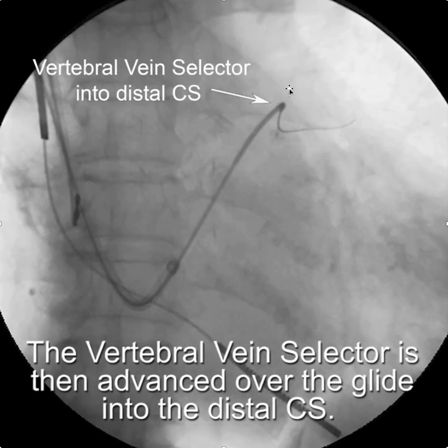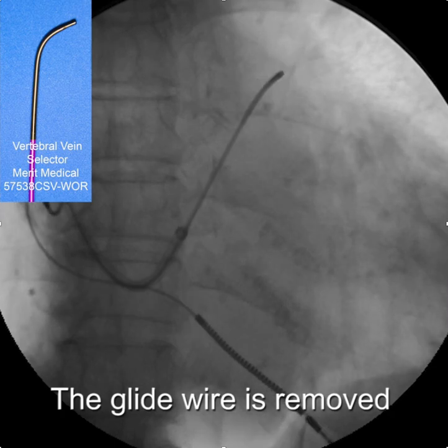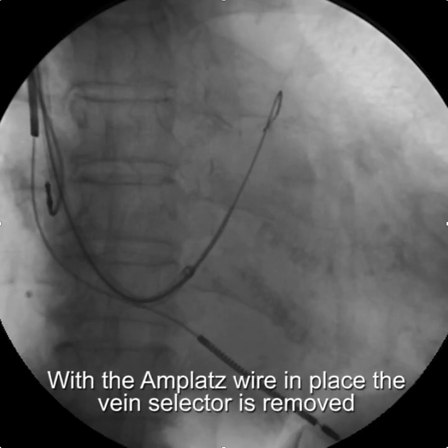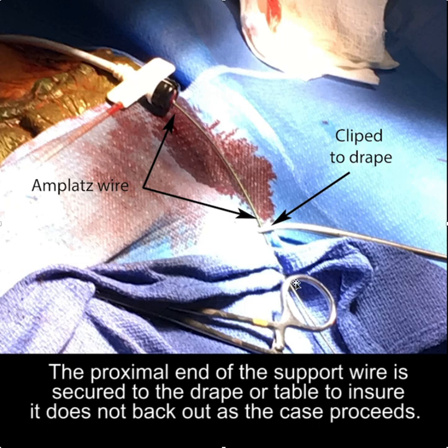Once you get the vein selector to the tip position, we remove the glide wire and replace it with a 0.035, 180-centimeter Cook AMPLAT extra stiff wire, which is then advanced through the vein selector. You are in effect depositing the AMPLAT wire in the coronary sinus rather than advancing it. Once you get the AMPLAT wire nice and deep into the coronary sinus, you remove the vein selector.